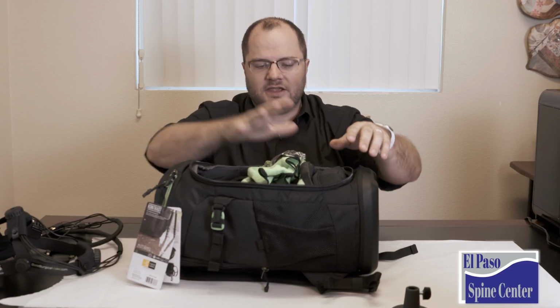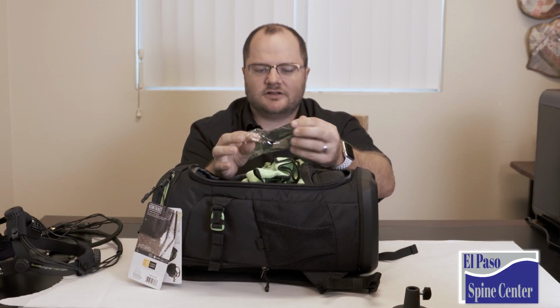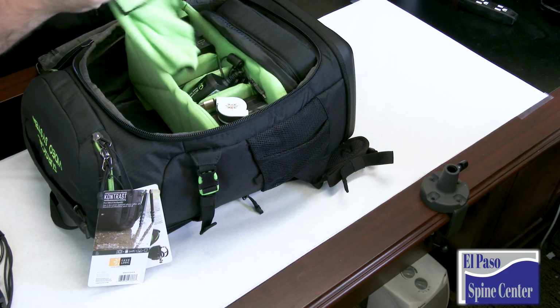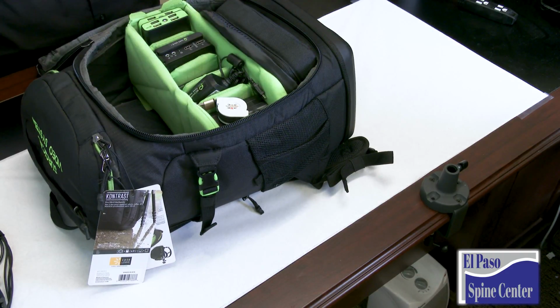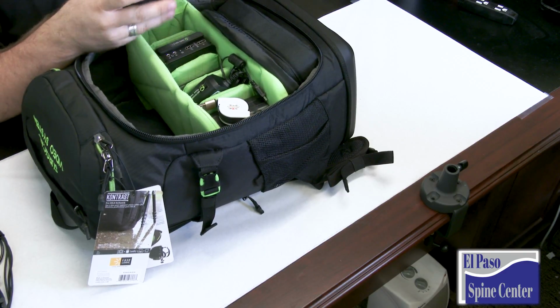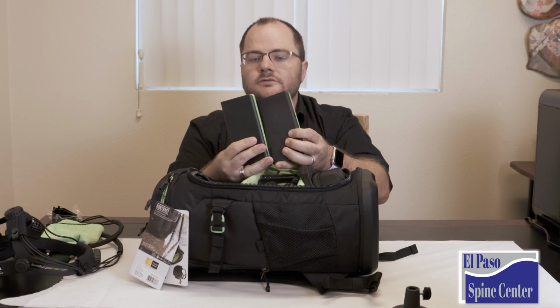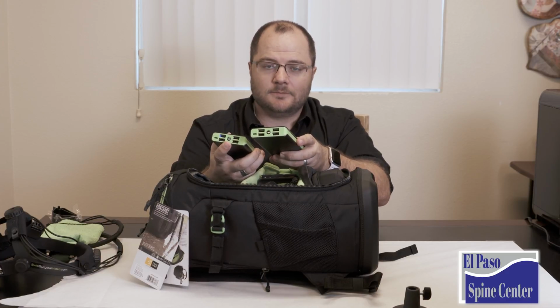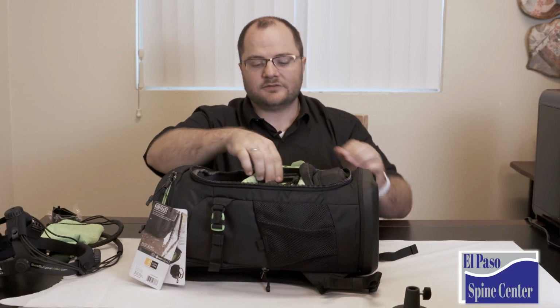So back in our backpack, we have a plastic clip that can be used for cable management. When you get into the main pieces, there is a lovely microfiber cleaning cloth. In the center part of the console, there are two large USB bricks. We're going to come back to how we use those. Each one has four full-size USB outs and one micro USB in for charging. We're going to come back to those in a little bit.